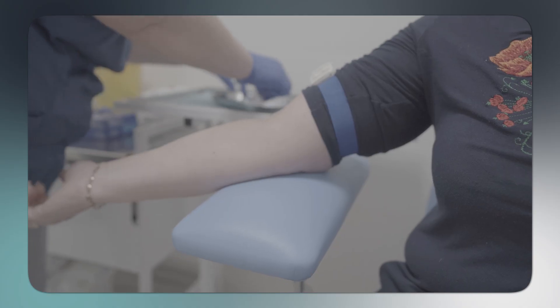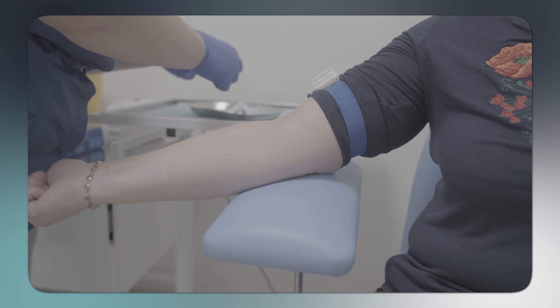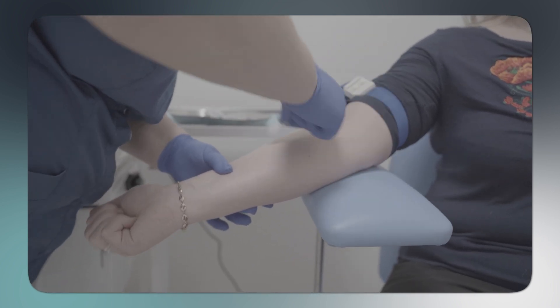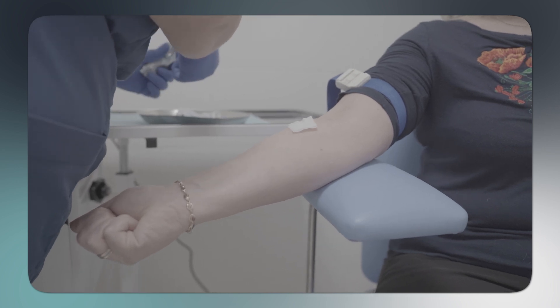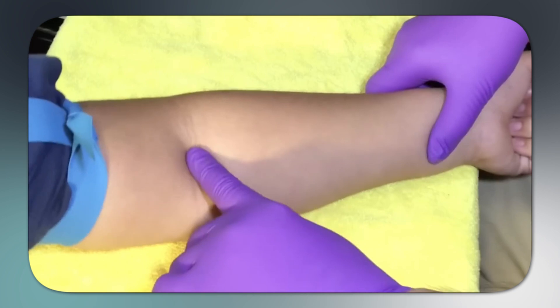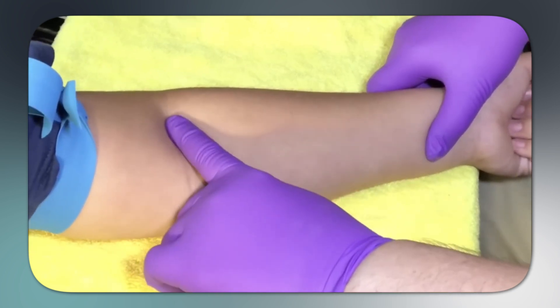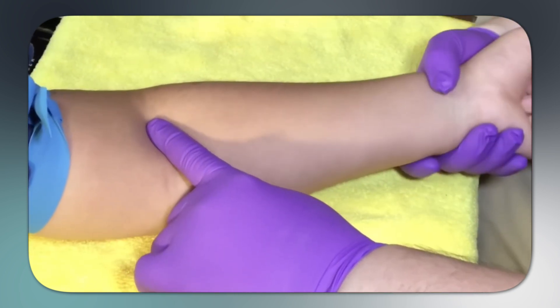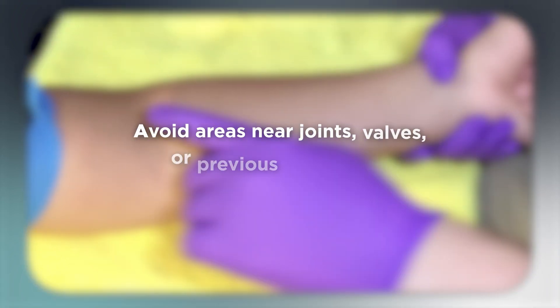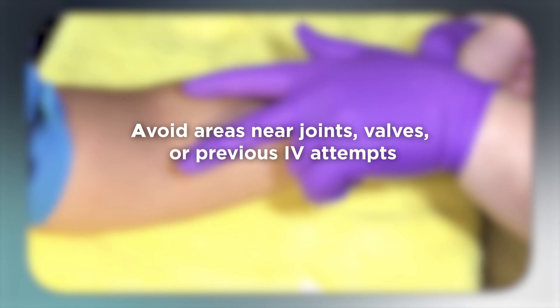Step 1: Vein selection. Finding a good vein is half the battle. Apply the tourniquet about 5 to 10 centimeters above your intended insertion site. Have the patient make a fist to help engorge the veins. Look for straight, bouncy veins that don't roll. Palpate the vein — it should feel spongy and resilient, not hard or pulsatile. Avoid areas near joints, valves, or previous IV attempts.